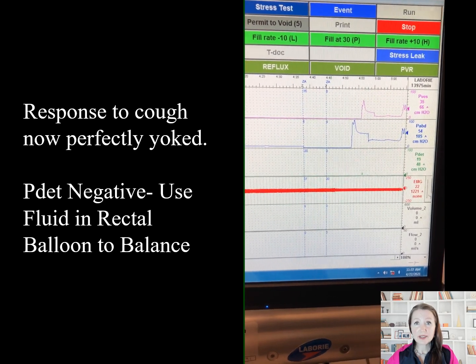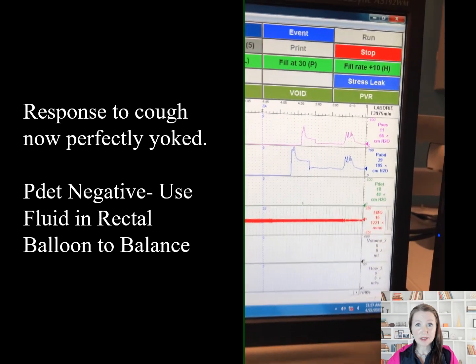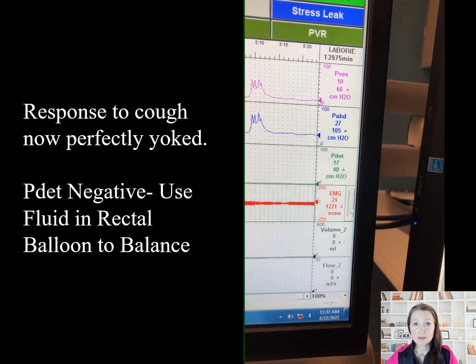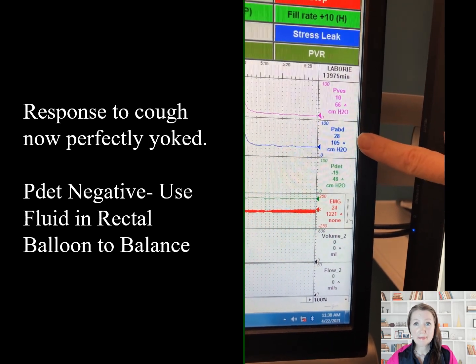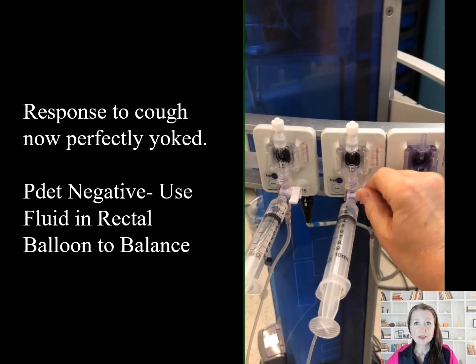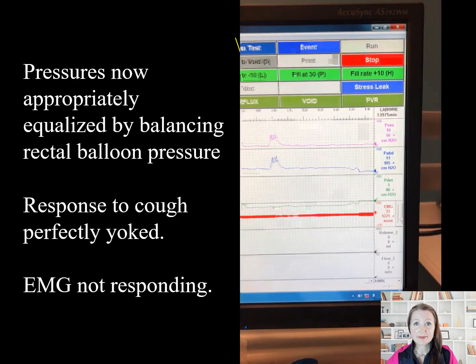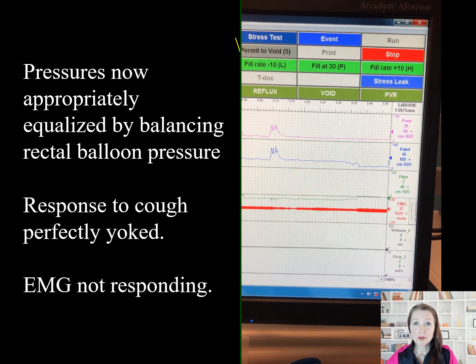We are now zeroed. The response to cough is perfectly yoked. Graph clipping has been left on, so it's subtle to realize that the P-DET is negative. The pressure in the rectal balloon is used to regulate and balance the relative pressures between the two zeroed catheters. Here we toggle off to the transducer and withdraw some fluid from the rectal balloon. We now have the P-DET within 5 of 0 — our goal for starting the study.